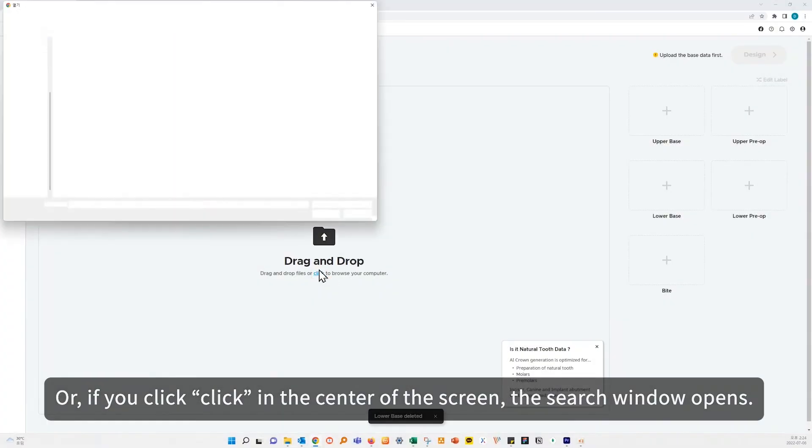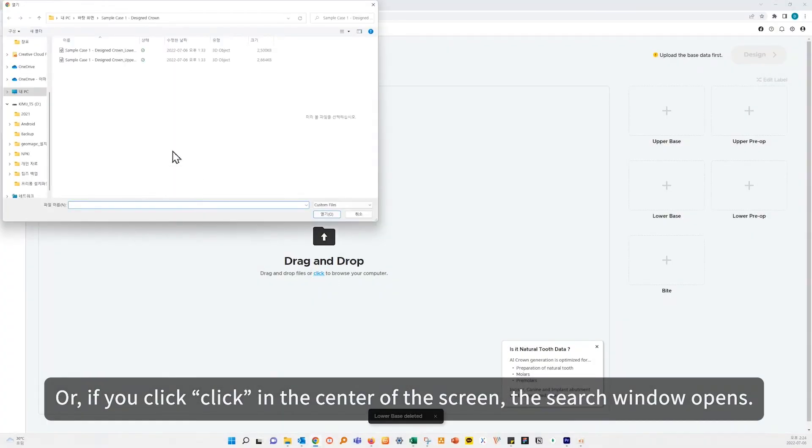Or if you click in the center of the screen, the search window opens.